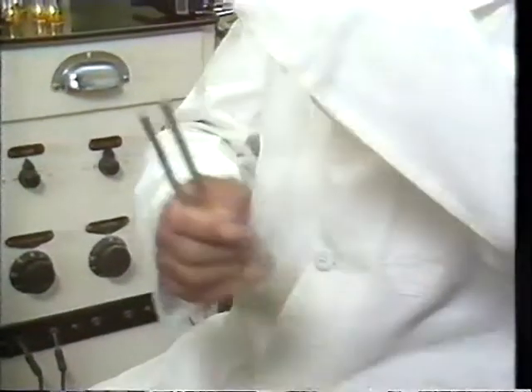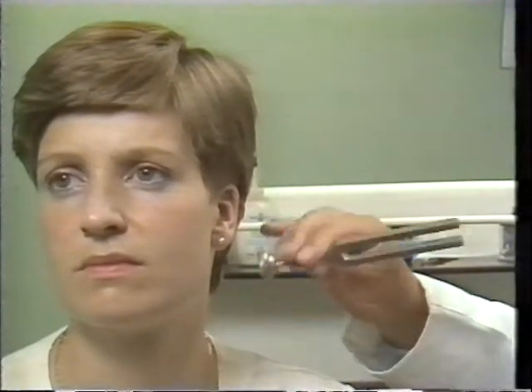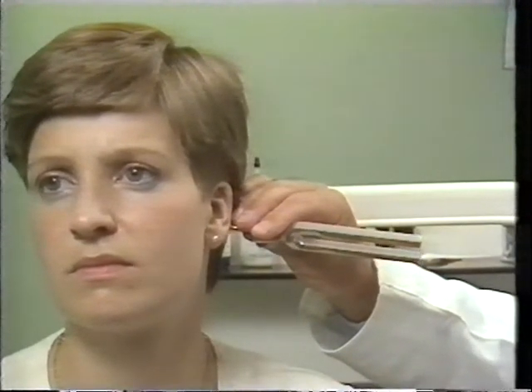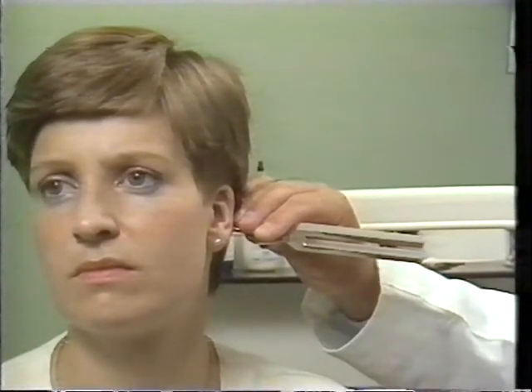In the Rinne test, a comparison is made between the patient's ability to hear by air-conducted sound with a vibrating fork presented to the meatus and bone-conducted sound with the foot of the fork on the mastoid process behind the ear. One can ask the patient, which do you hear better, behind or in front? In front of you.